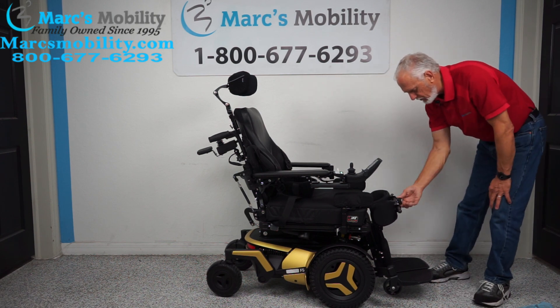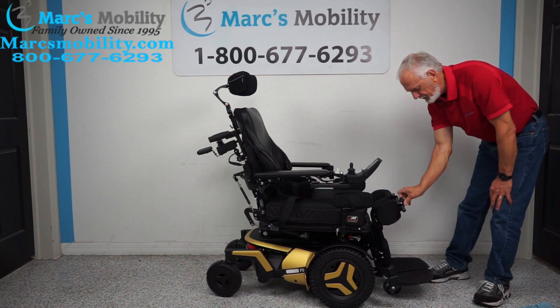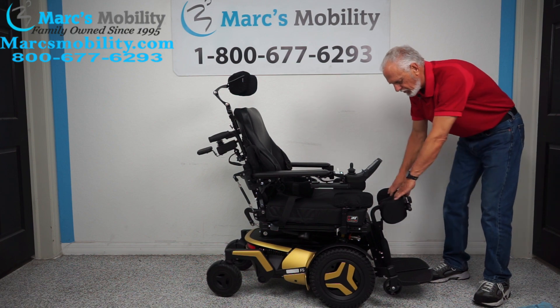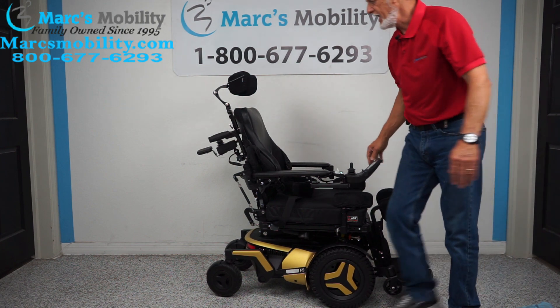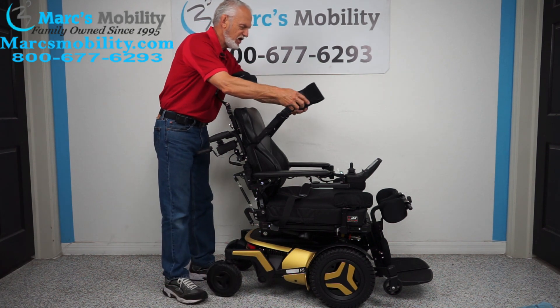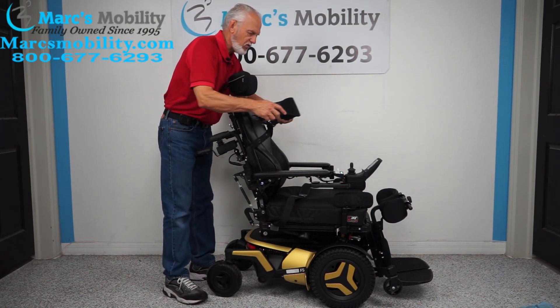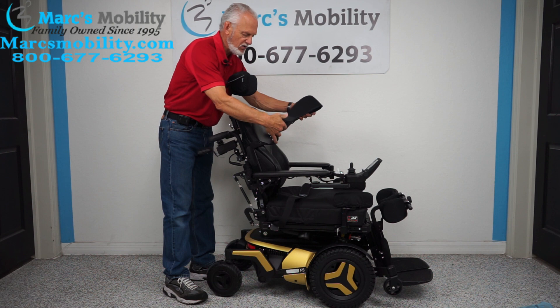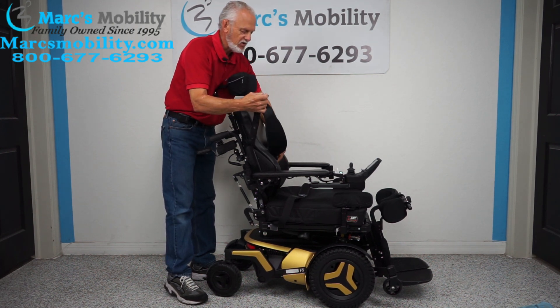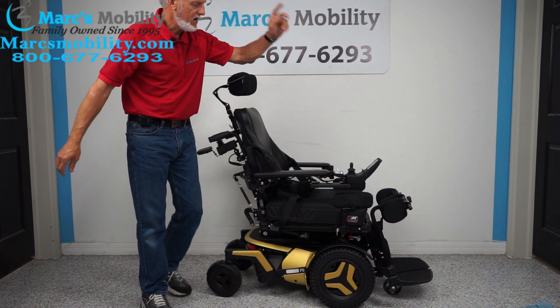The knee brace is adjustable by turning this knob right here — you can see it moving forward. We're going to move it forward as far as it'll go. The second thing you need if you're going to stand someone up is the chest guard. You need to put it at whatever tightness you want; you can adjust it with this little strap right here. So you have to have the chest guard and the knee brace.